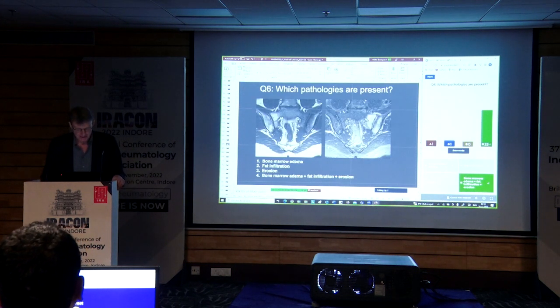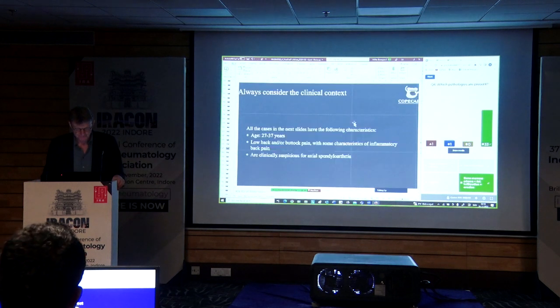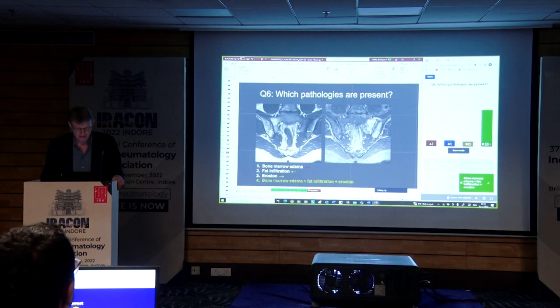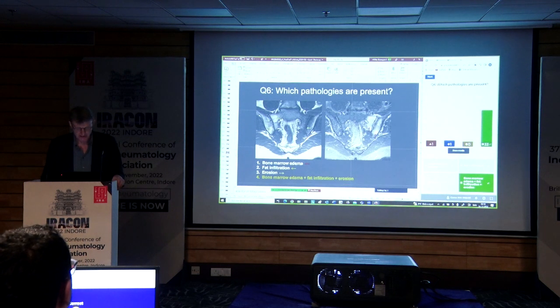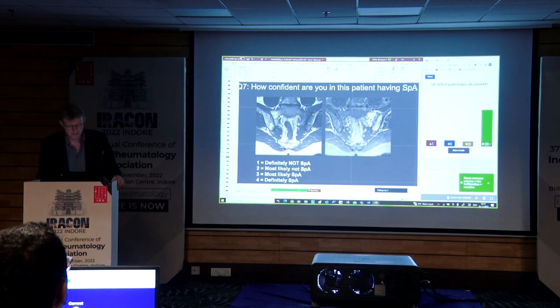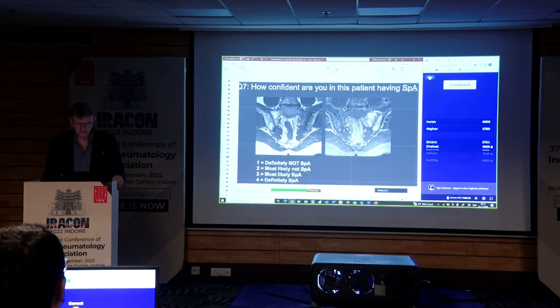Yes, and that's just the same thing I just said. So now I come to this question. This is the answer, right? And then the question is here, given that the patient has a reasonable history, as I told you, how confident are you in this patient having SPA or not?